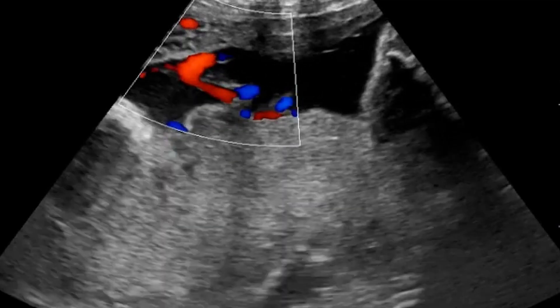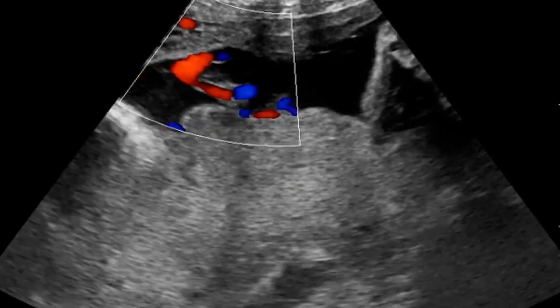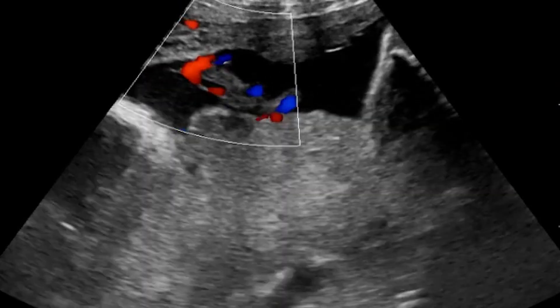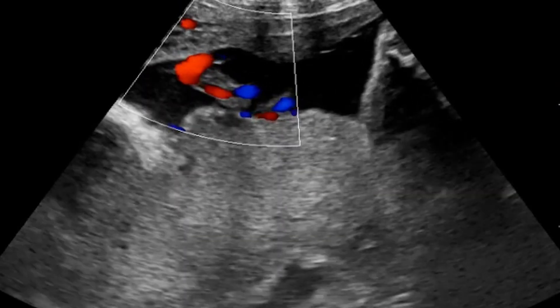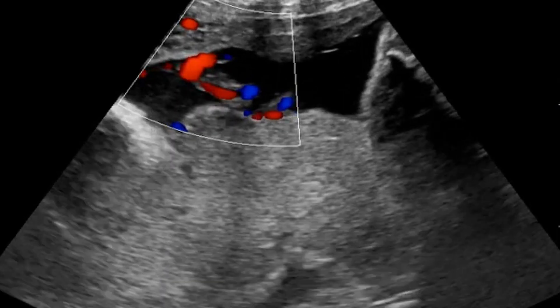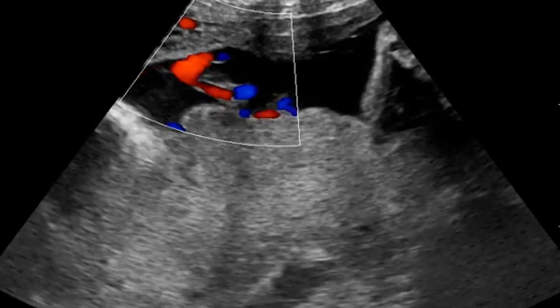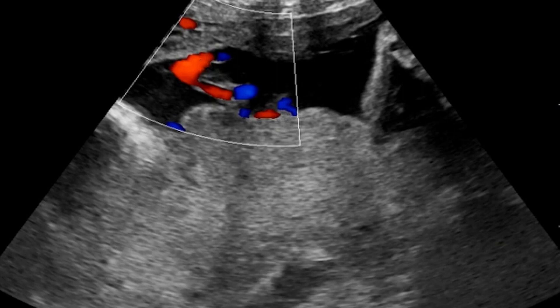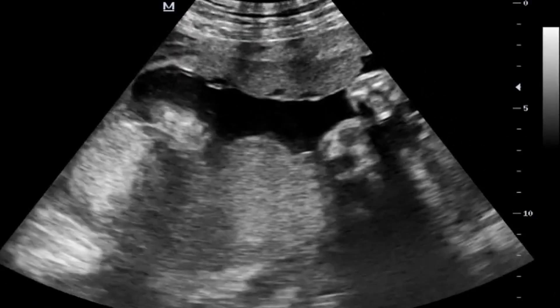This is a pregnancy that needs close monitoring. The mother previously had a history of a stillbirth but also has one living child. You can appreciate the flow there — this is before any detachment.